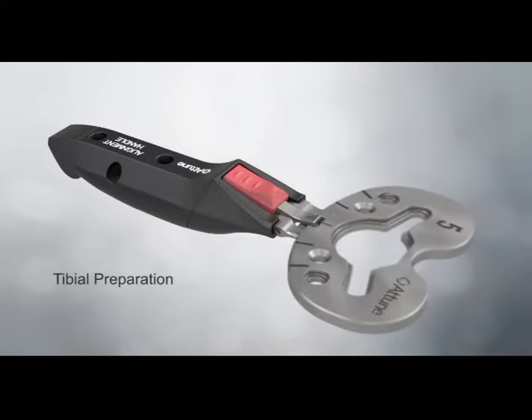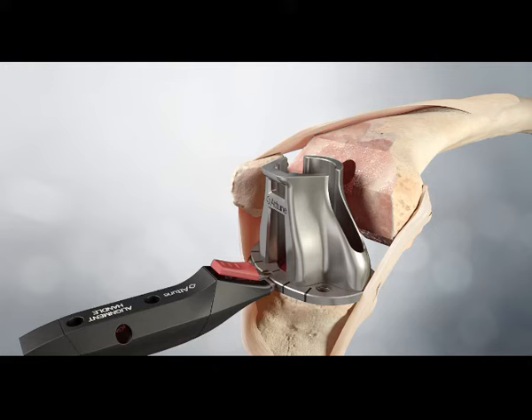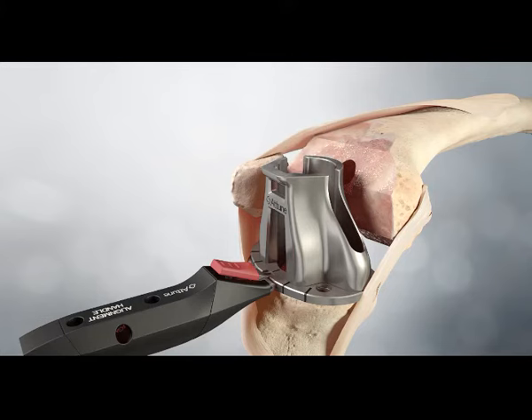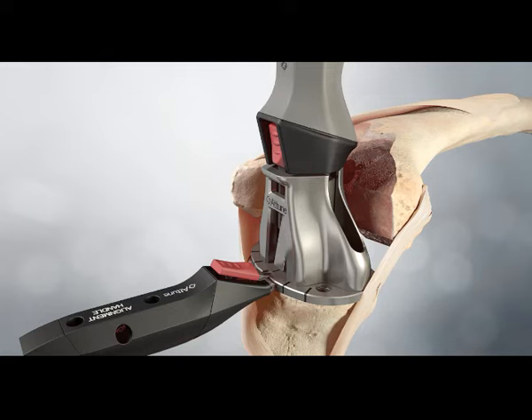Tibial preparation. Once the tibial base trial is positioned for coverage and tibial rotation, the drill tower is attached with the spikes on its underside engaging with the two holes on the anterior aspect of the base trial. These spikes provide fixation for both the drill tower and base trial. The tibia is reamed to where the size mark on the side of the drill aligns to the top surface of the tower. The correct size keel punch is attached to the impaction handle and inserted into the drill tower. The assembly is impacted into the cancellous bone until the keel punch is seated flush on the base trial. When the punch is fully seated, the impaction handle will automatically disengage, allowing the handle and drill tower to be removed together.